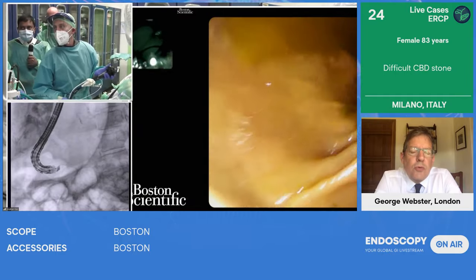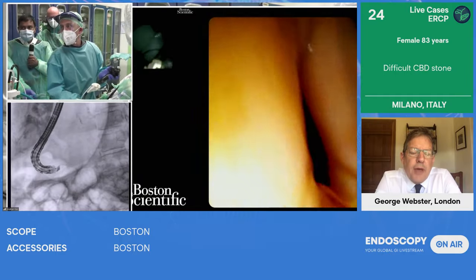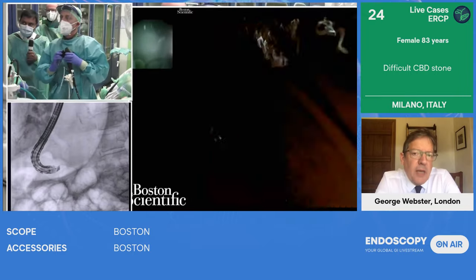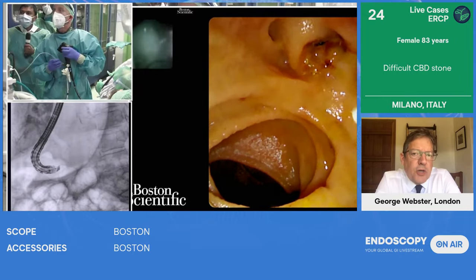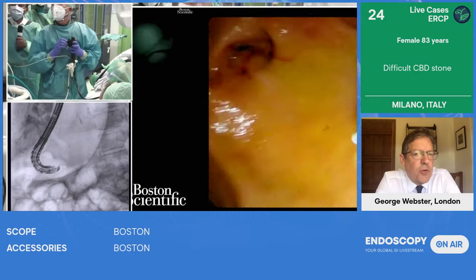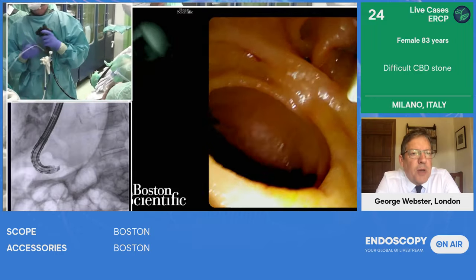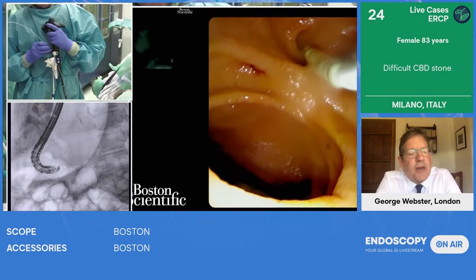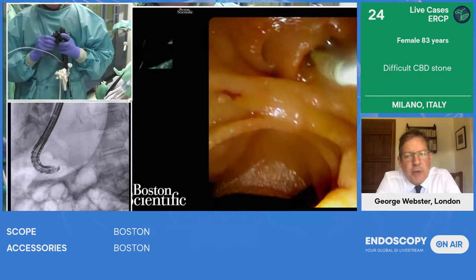Andrea, all these patients will have a sphincterotomy prior to insertion of the SPY scope. Do you often do a balloon sphincteroplasty, even if you know that you're going to do cholangioscopy?